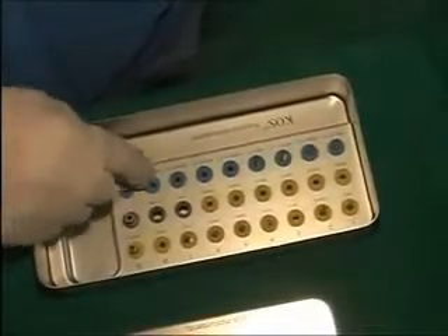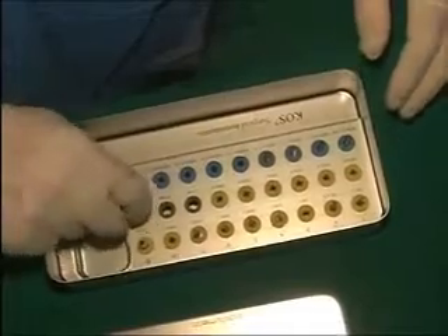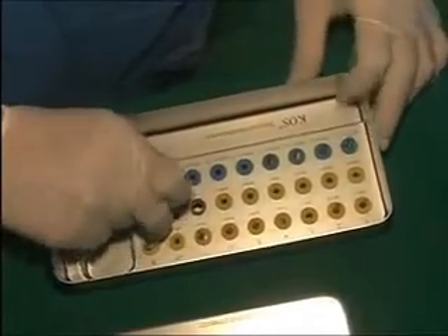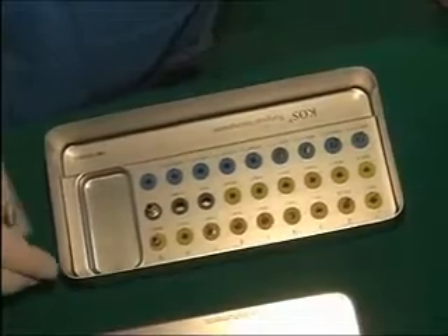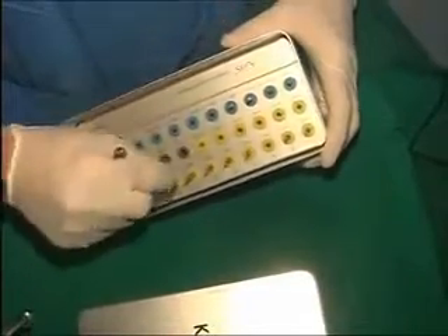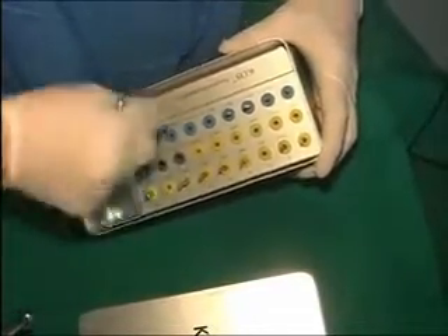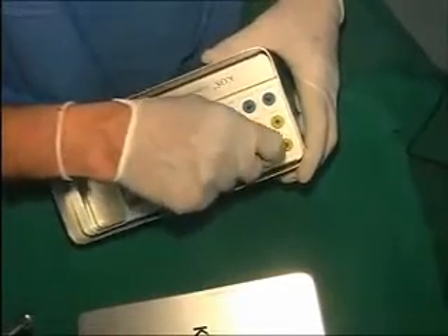If you saw some of my older kits, they did not have this Teflon bearings here. Now, when I invert this kit, none of the drills fall. If you saw my earlier kit, they were having these white rings here and the drills were very loose. Now these are Teflons, so everything fits with friction inside and it remains stable.